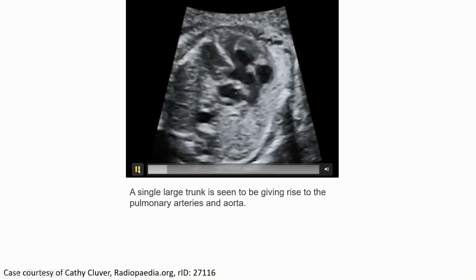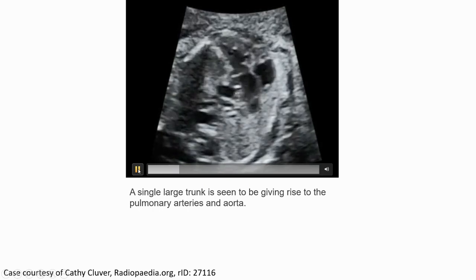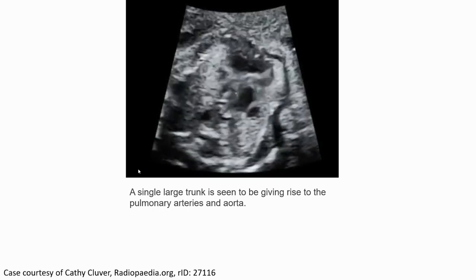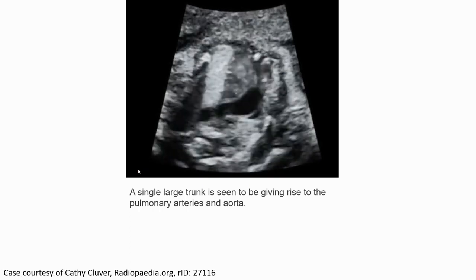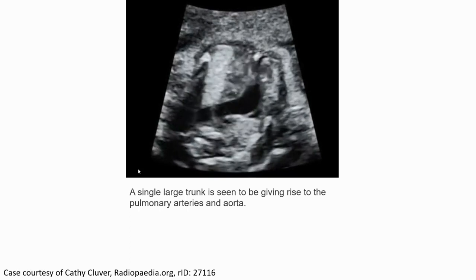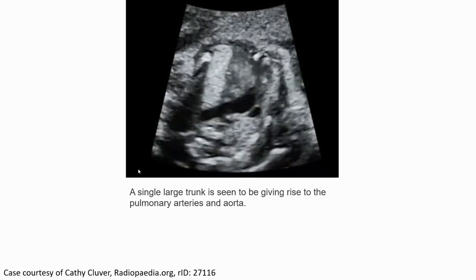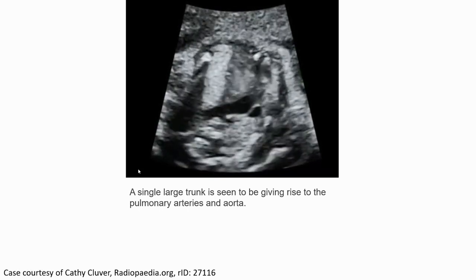This is a single large trunk, and it appears to be giving rise to the pulmonary artery.